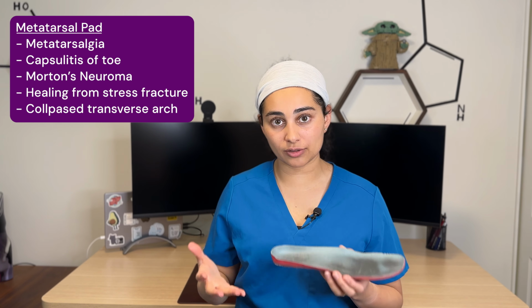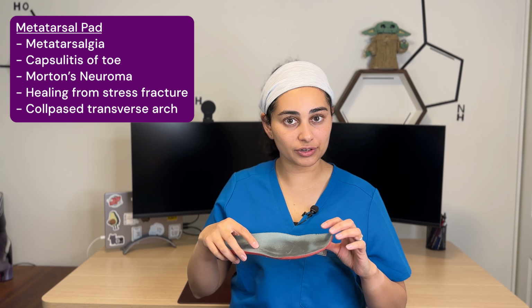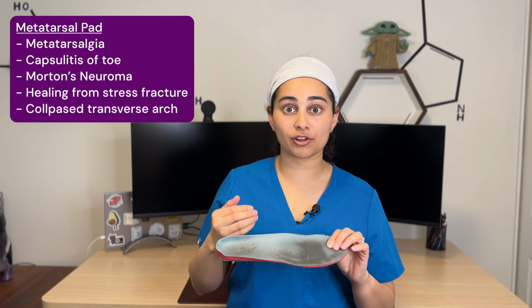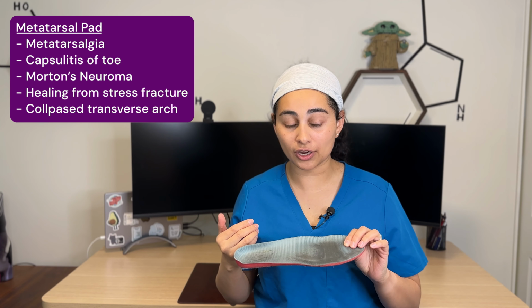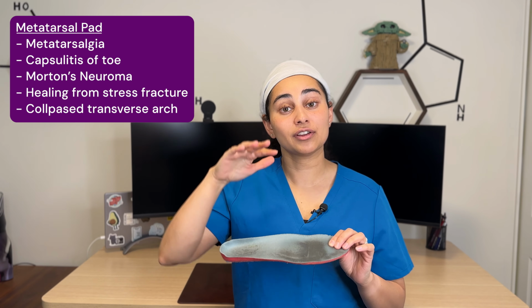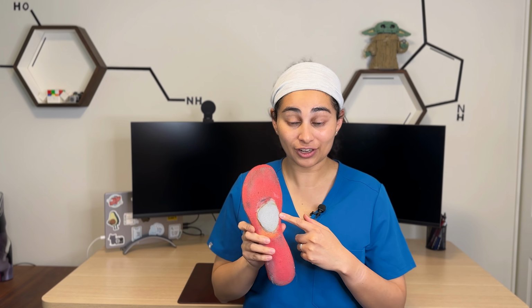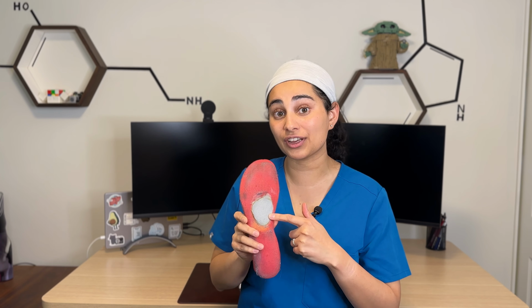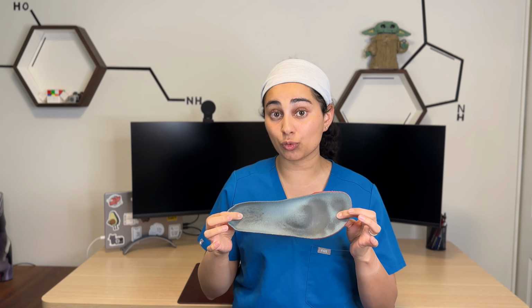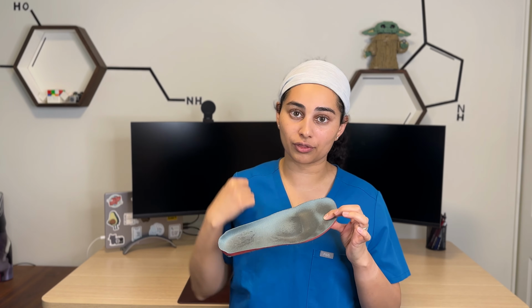So what conditions can this be used for? Metatarsalgia, capsulitis of the second toe, for example, recovering from a stress fracture after you've booted it for a period of time, patients who have a Morton's neuroma, and it can also be helpful in those who have very flat, fallen feet. This is a very easy thing that you can buy online yourself, and then you can apply it to your insoles on your own as well. But very specifically, you're going to want to look at a YouTube video on how to apply it, because it's applied behind the ball of the foot, not on the ball of the foot.